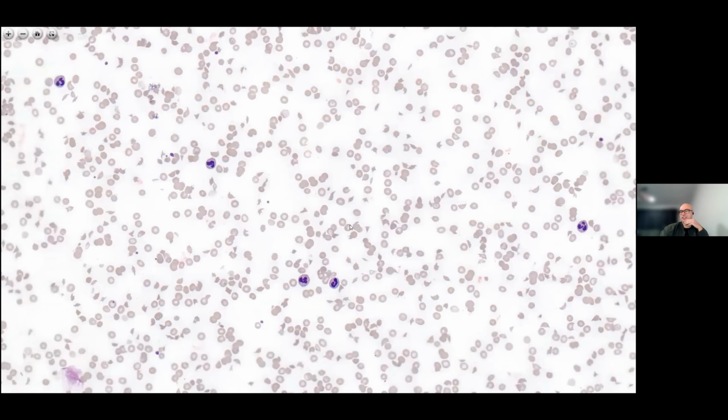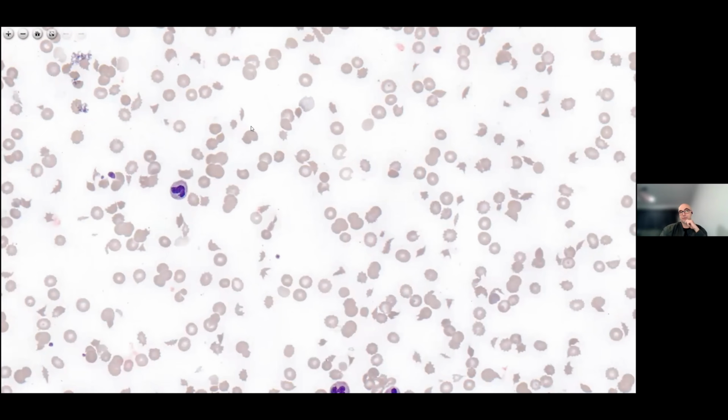But one thing to remember when you're looking at a blood film is we're getting quite excited that we're seeing all these very significant red cell morphologies, and you know, ooh, this might actually be a textbook case for something very significant that every good morphologist should know.